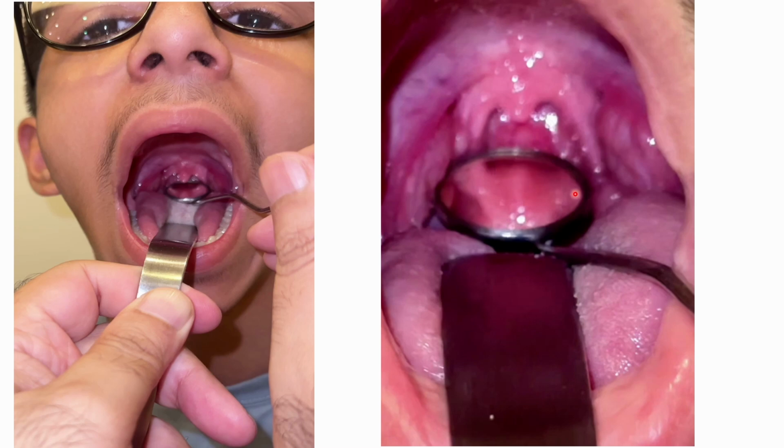to find. Again, remember that in indirect laryngoscopy, it is easy to visualize the structures more clearly than in posterior rhinoscopy. In a very cooperative patient or who has a slightly widened nasopharynx, the structures can easily be visible. Otherwise, the best way to examine the nasopharyngeal structures is rigid nasopharyngoscopy, rigid nasoendoscopy, or flexible nasopharyngoscopy.